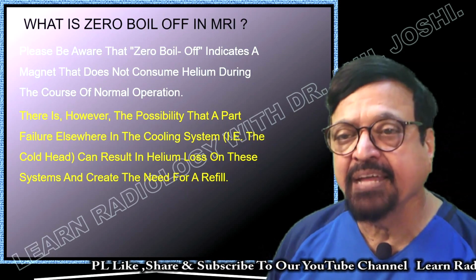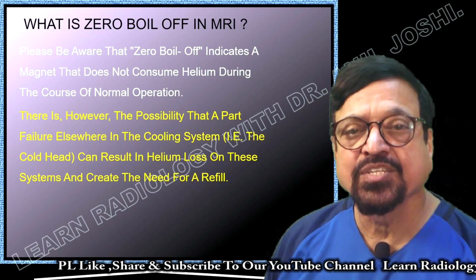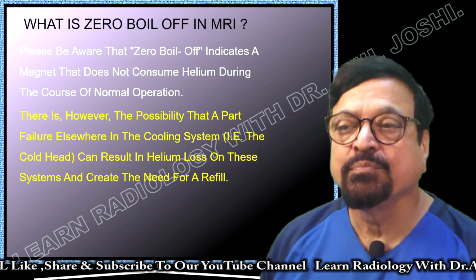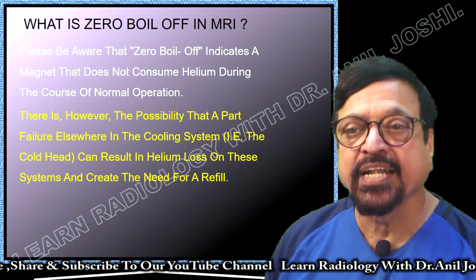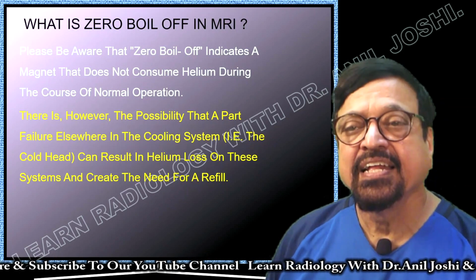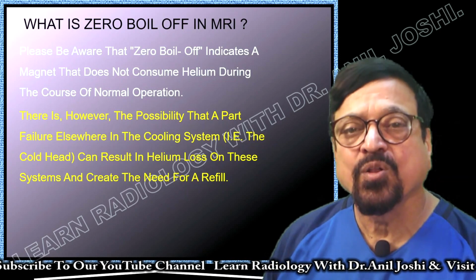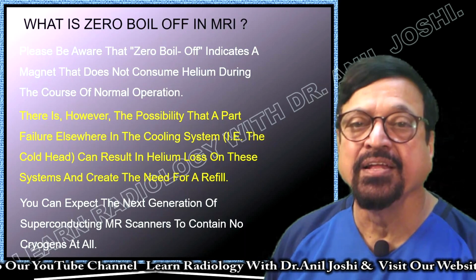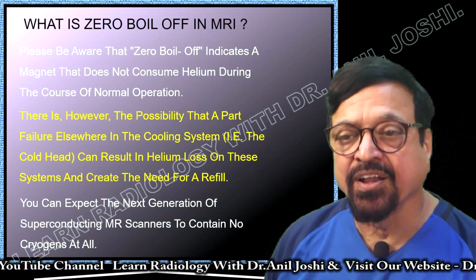In that way, clearly mention what the maintenance is, what it does, and what will happen if there is no maintenance, because this is the main component in the cycle where there can be big losses of helium, and these are preventable. This can be detected early.